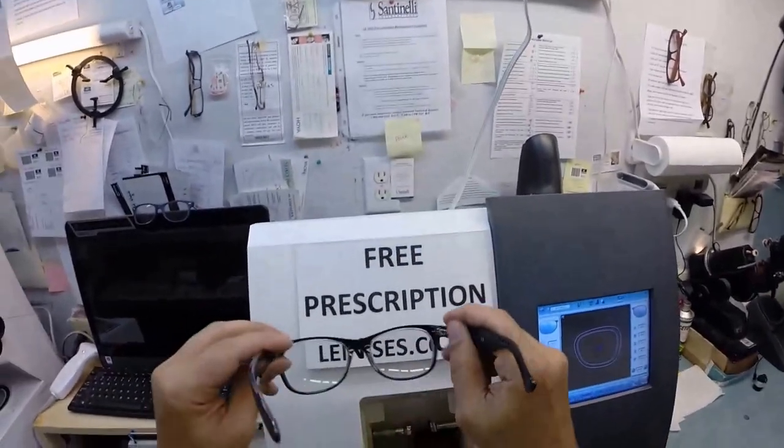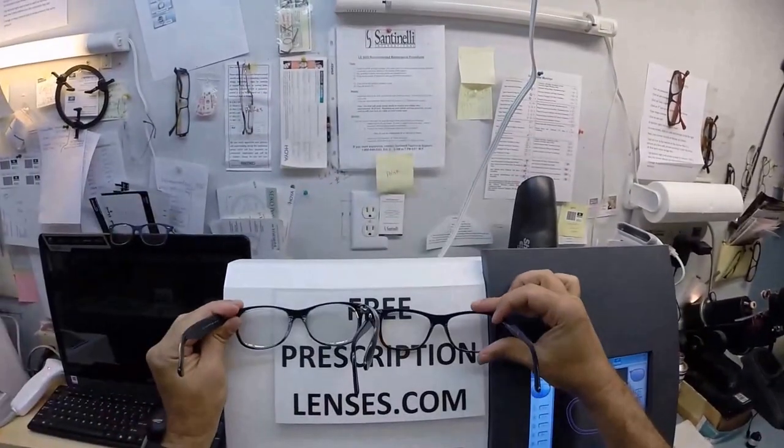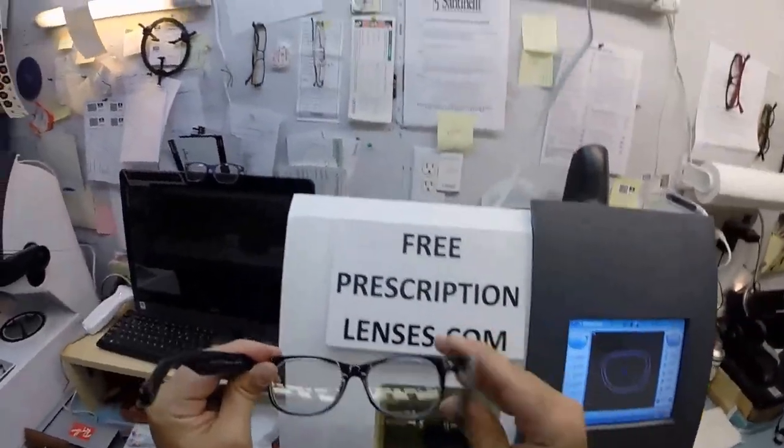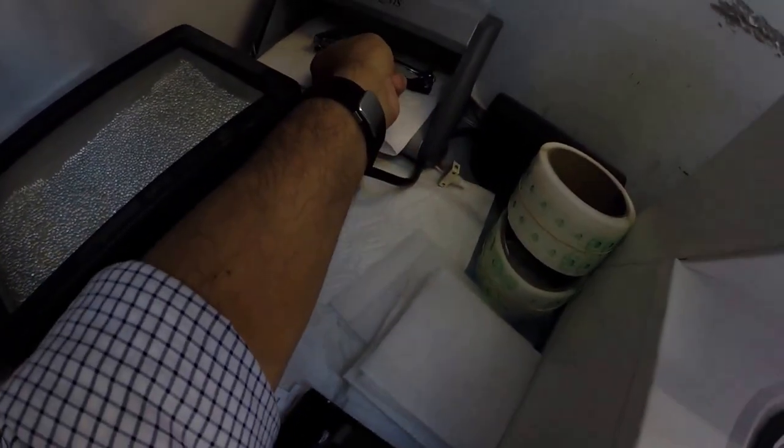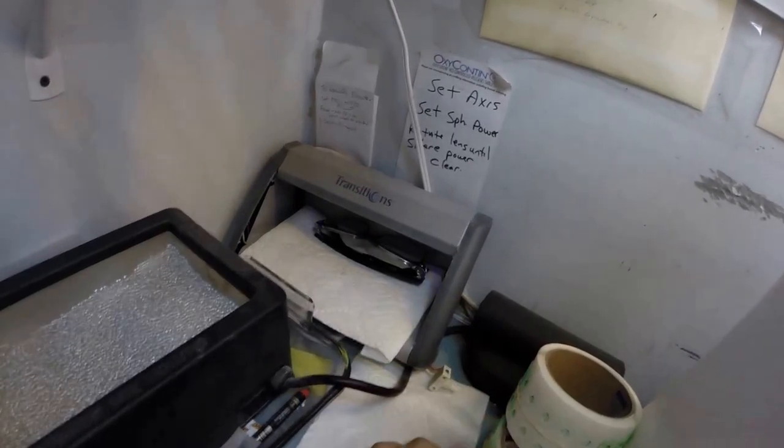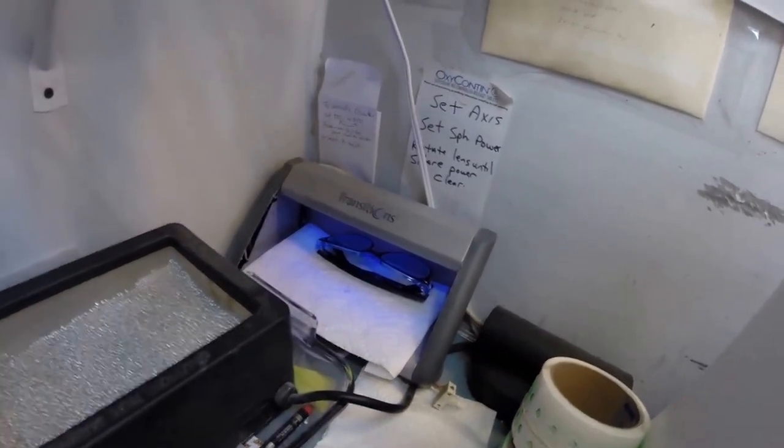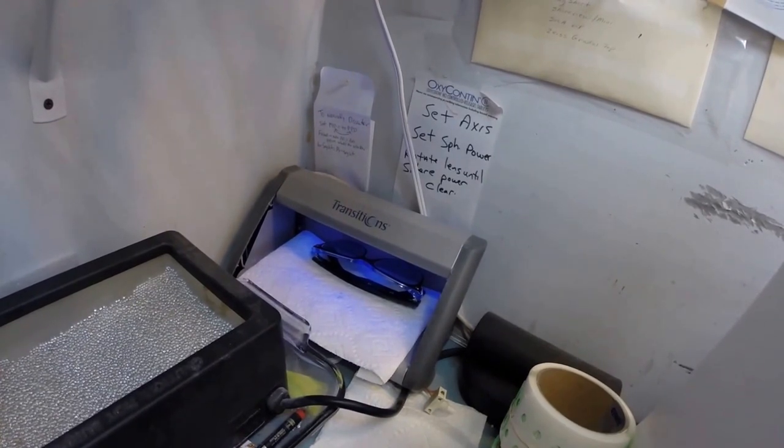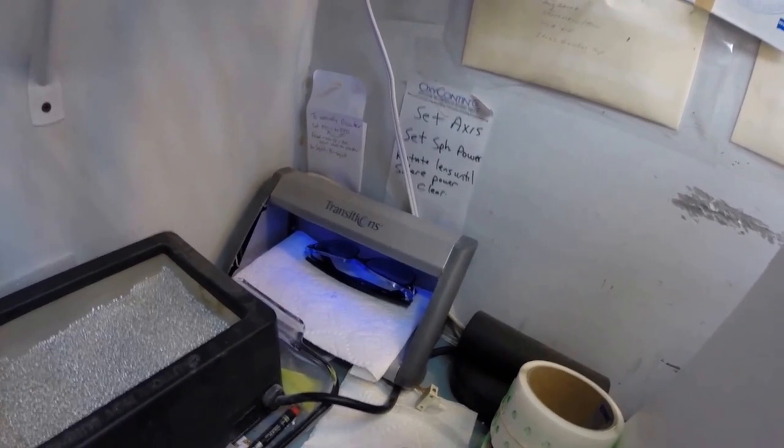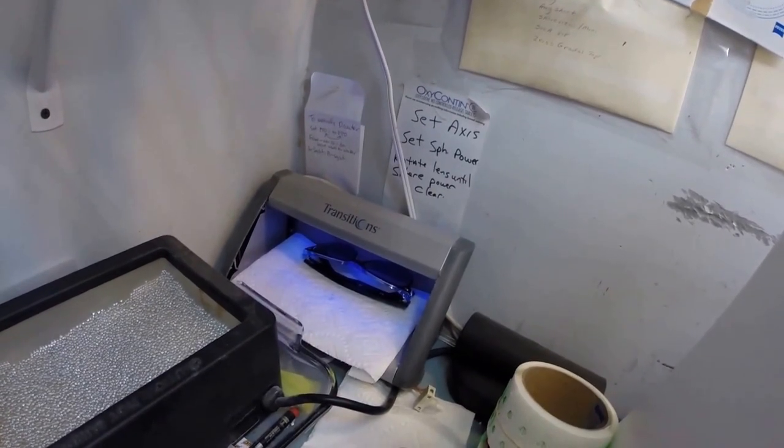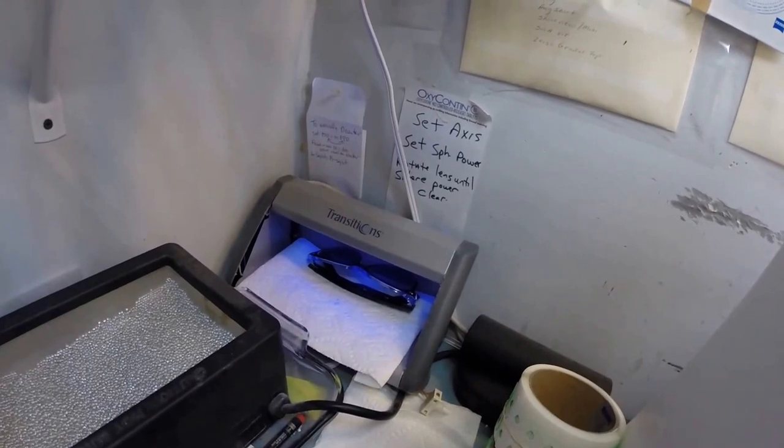This is what your lenses look like clear versus mine. Again, just a little bit of tint while indoors. Now let's go ahead and activate them. I'm gonna show you what they look like when they've been darkened. I've got my little transitions box in the corner which just has a strong UV light on the inside. I'm gonna turn that on and expose them to a strong burst of UV light. As you can see it takes about 30 to 45 seconds for transition lenses to darken, about 45 seconds to a minute to a minute 15 to return back to virtually clear when you go back indoors.